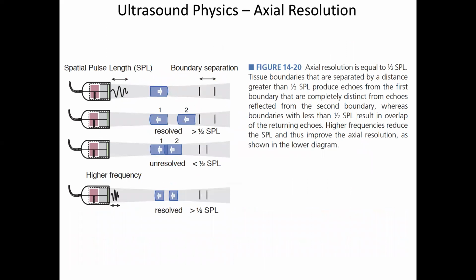But looking ahead, this is how it's actually done. You put out this little burst pulse that's short. It's going to travel along, and if I have two boundaries in the sample, it'll reflect off the first boundary and then reflect off the second boundary. And so our 1% signal is coming back towards us. And we turn this into receiver mode and we hear these echoes.